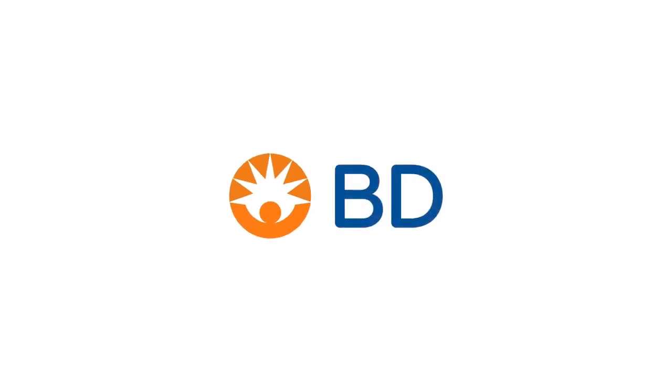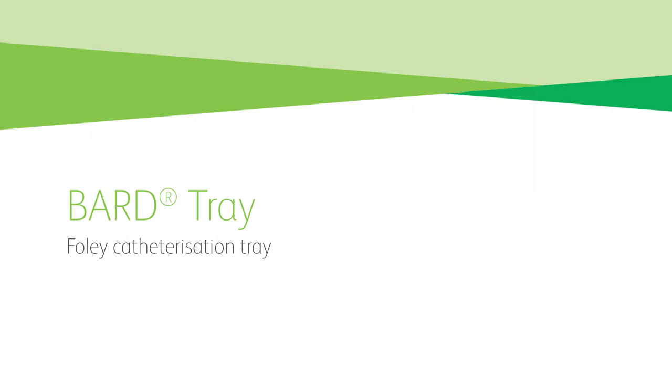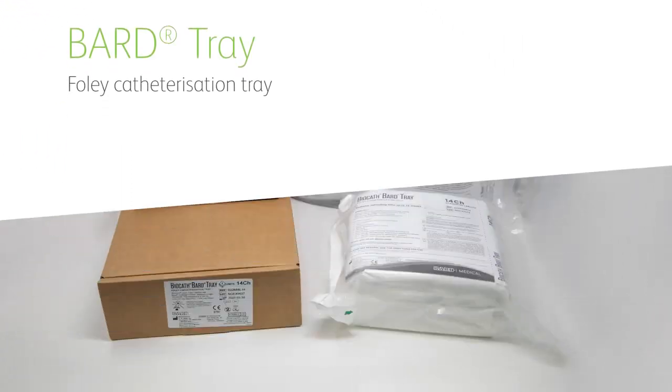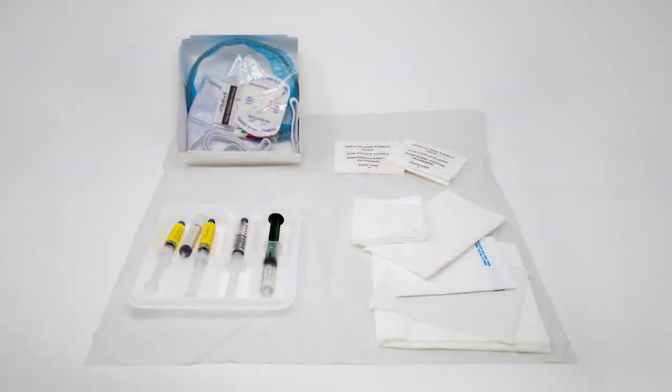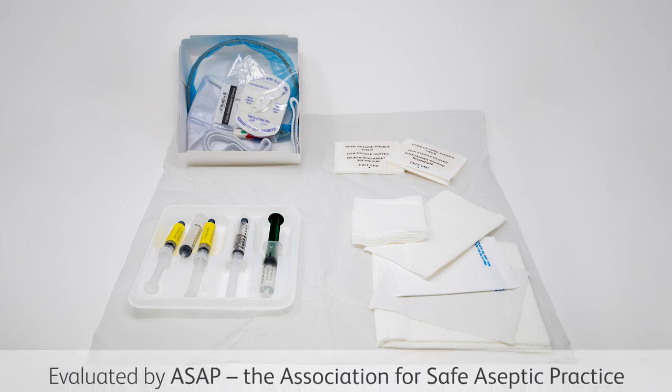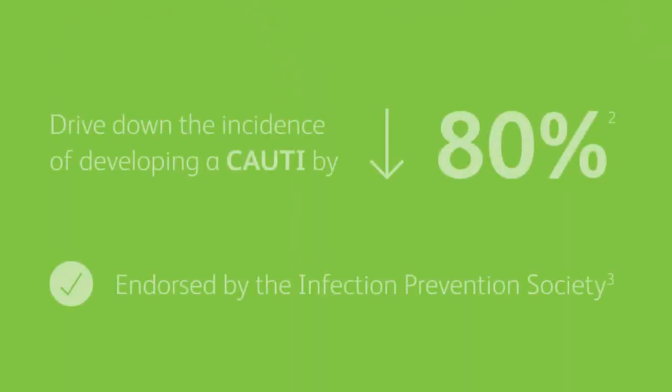BD is committed to patient safety by promoting standardisation of product choice and practice to help reduce the risk of infection and complications associated with catheterisation. The BARD tray is packaged with the essential components needed to perform an aseptic catheterisation procedure and has been evaluated by the Association for Safe Aseptic Practice to support aseptic non-touch technique. Using a Foley tray can drive down the incidence of developing a CAUTI by 80%, and it has been endorsed by the Infection Prevention Society.